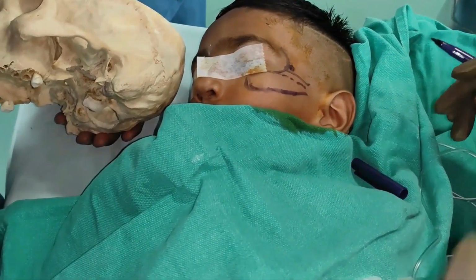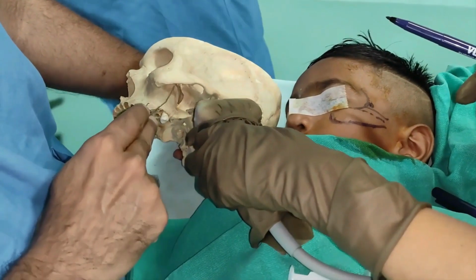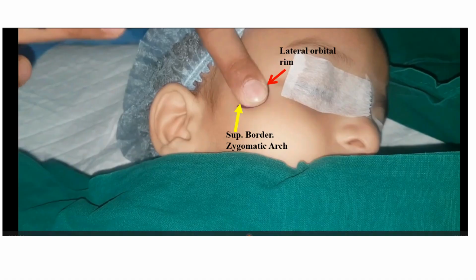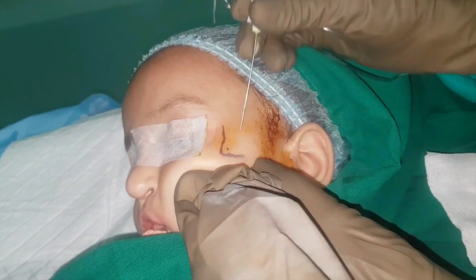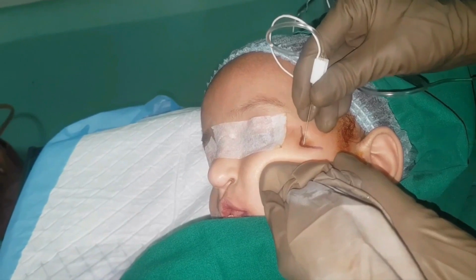The fingers are pointing out the trajectory of the ultrasound beam. And here is the probe placement to achieve that. This is another simple way of palpating the needle insertion point as labeled. Watch out the needle being inserted and its trajectory underneath the zygomatic arch.